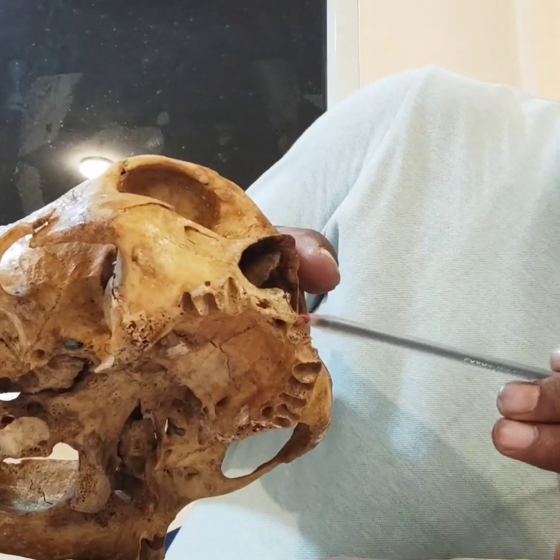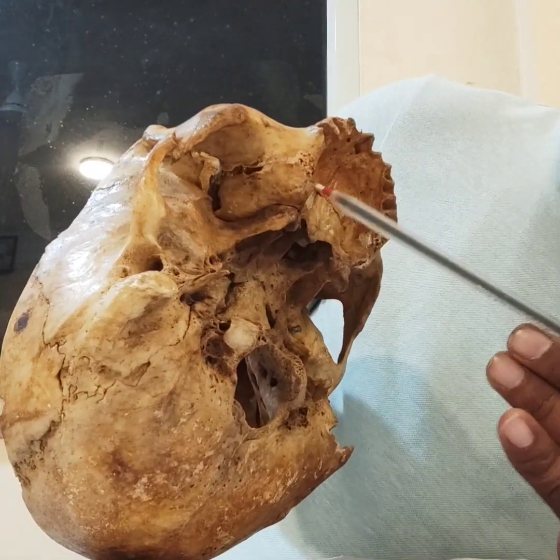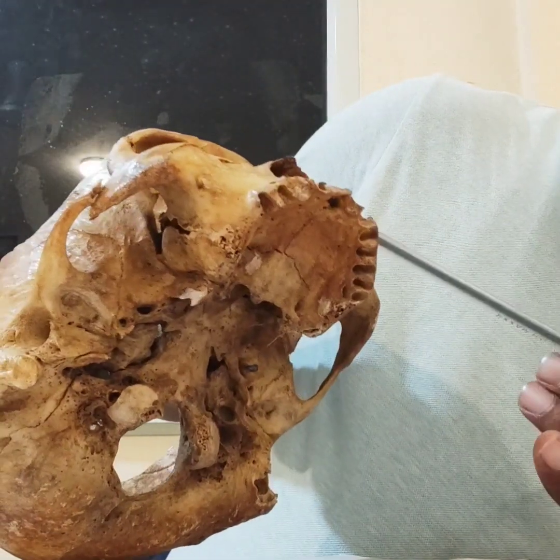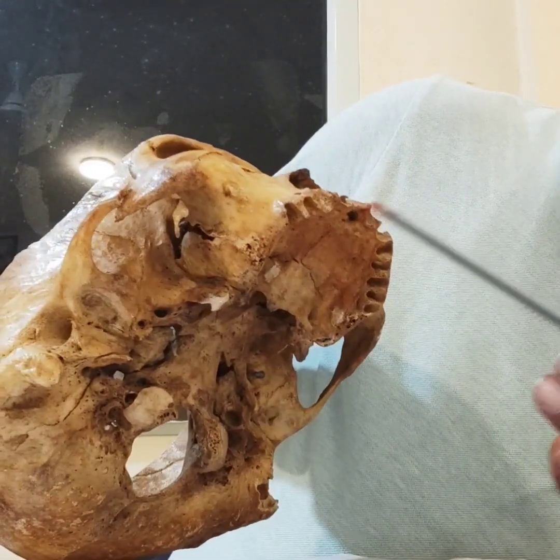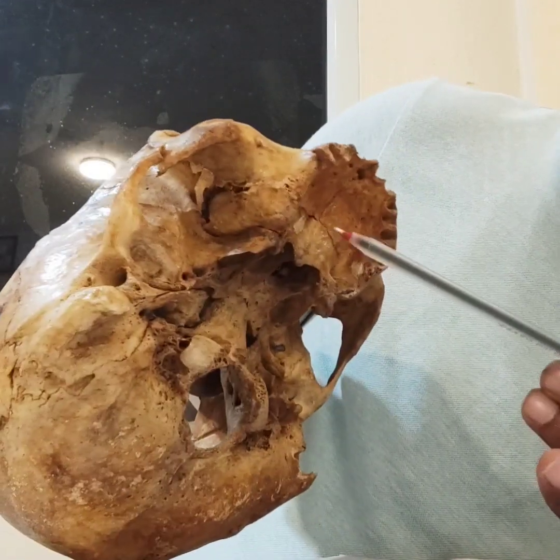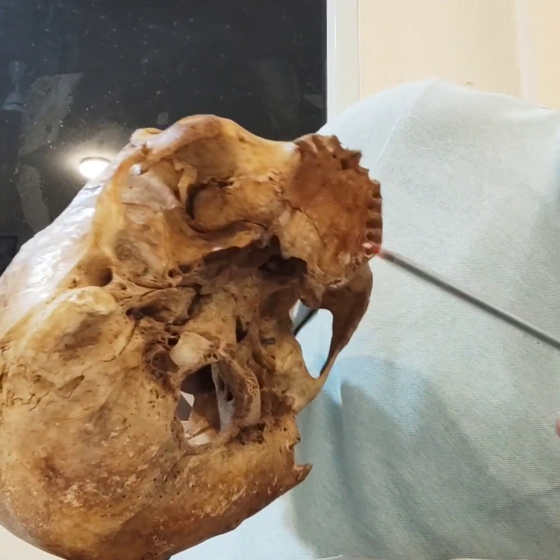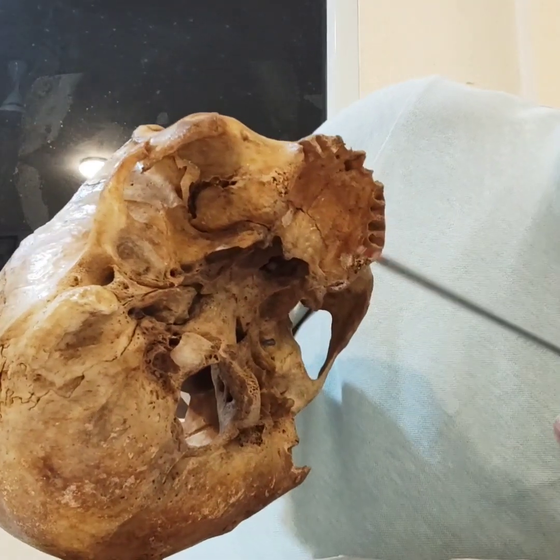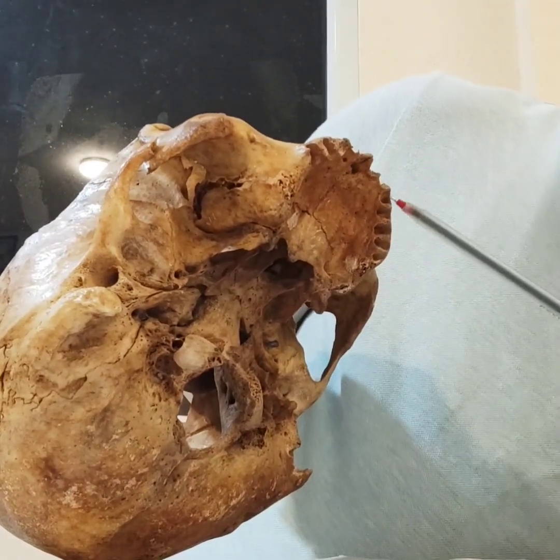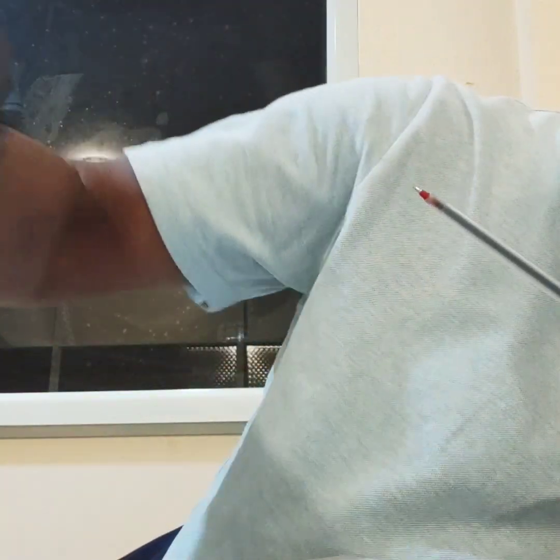In full mouth cases, anterior nasal spine engagement, posterior pterygoid engagement, and canine bypass are all utilized. From canine to canine we place six implants, and under both pterygoids we place double pterygoid implants — totaling ten implants in the maxilla for full mouth cases.